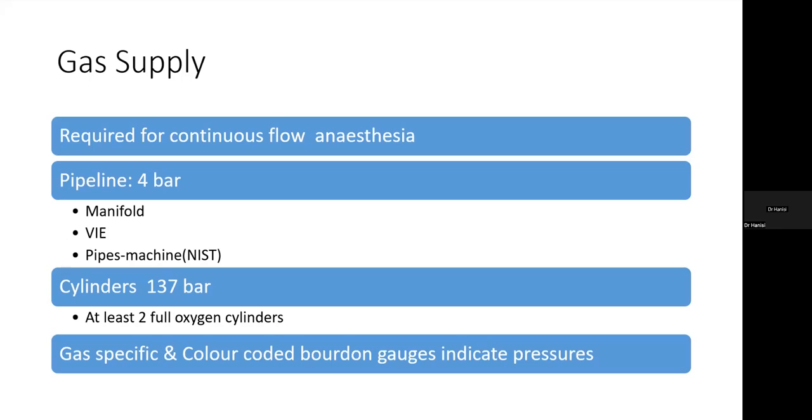From underuse, we said there will be pressure buildup, so the pressure releasing valve releasing into the atmosphere is also important for underuse. This is called the continuous use of oxygen. So it has to be always in use.